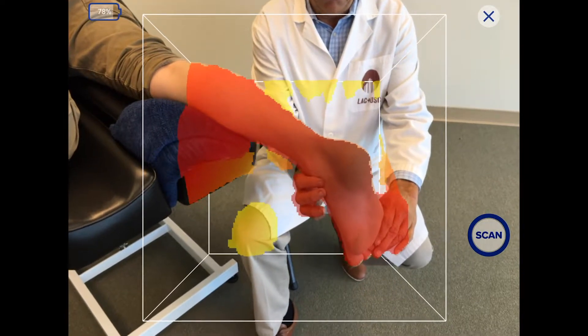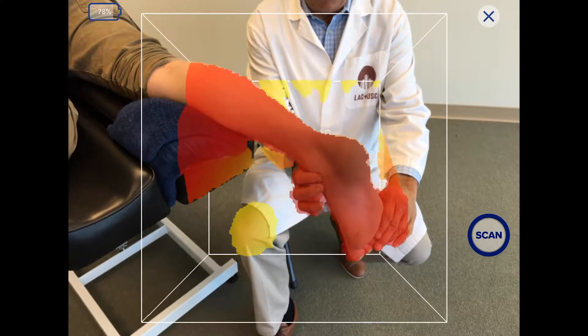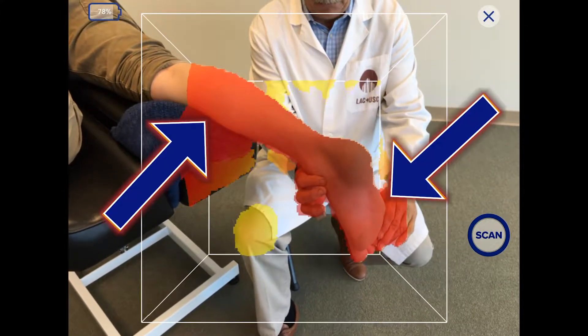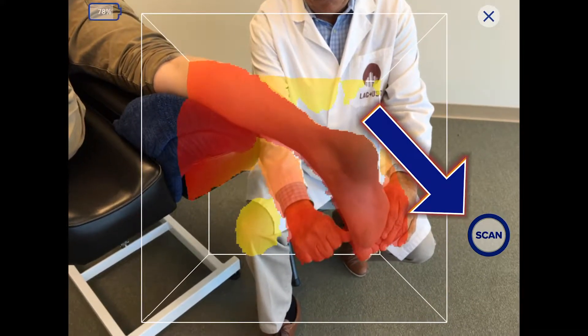Leave space around the foot and lower leg so as not to block the view of the scanner. Confirm the leg is in color, up to the height of the brace you are prescribing. To begin the scan, tap Scan once.